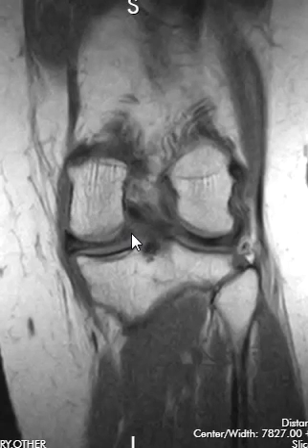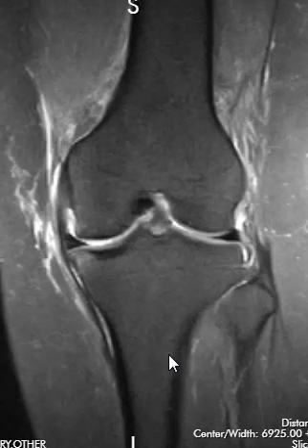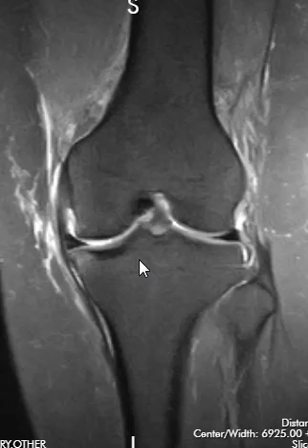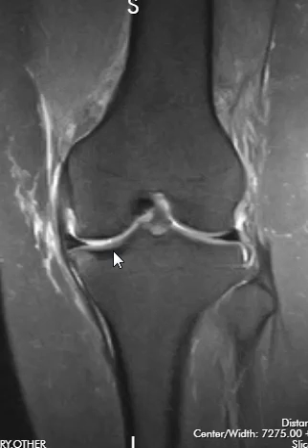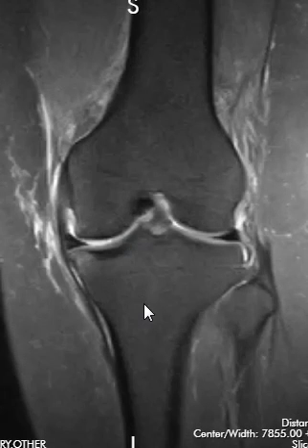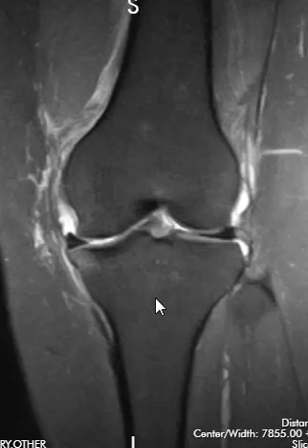And right back over here is where we'll see the tear. This is just another view, the same thing, but now the bones look dark and everything looks dark except for fluid. Fat and subcutaneous fat here looks dark, marrow that has fat looks dark, and the menisci look really dark. Fluid is white, so if there's a tear, it'll show up really nicely on this.